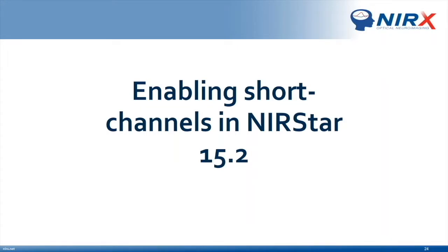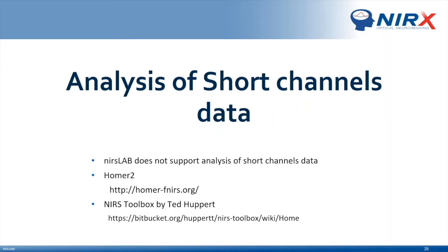And the last topic, which we are not going to discuss, is the analysis of short channel data. NIRSlab does not yet support analysis of short channel data. However, you could look into external sources such as Homer2 or the NIRS Toolbox by Ted Huppert.